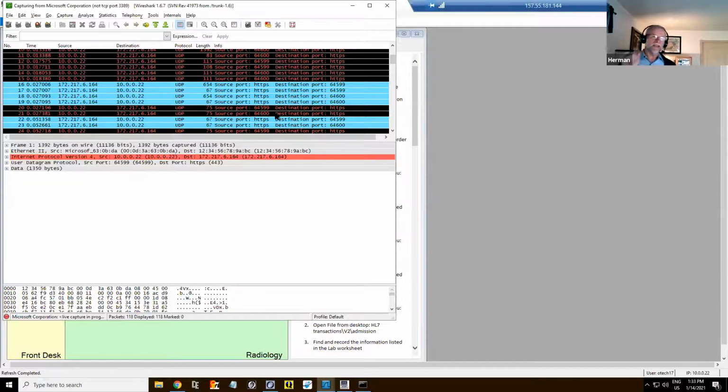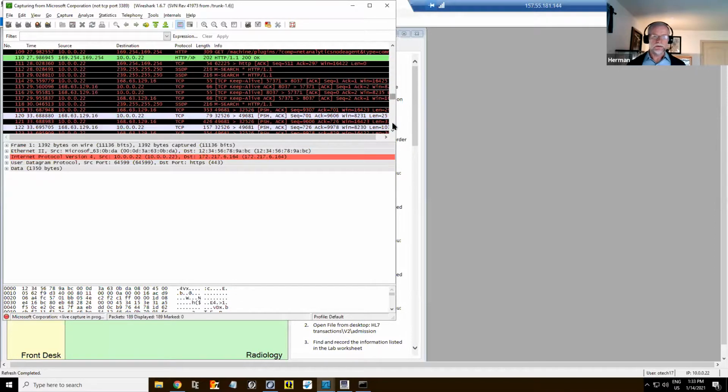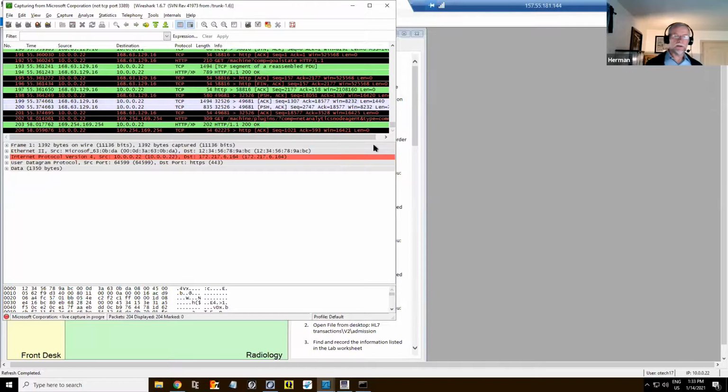Also, when I opened capture interfaces, it showed up only one. Typically, if you do it on your computer, for example your laptop, you might have a Wi-Fi and a fixed connection and maybe some Bluetooth, and they all show up there. So you need to make sure you pick the right interface. If you pick the wrong interface, of course, then you won't be able to connect. So this thing is just capturing nonstop, right? We haven't done anything yet.